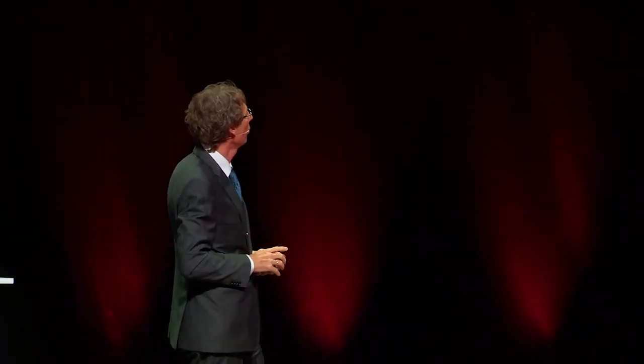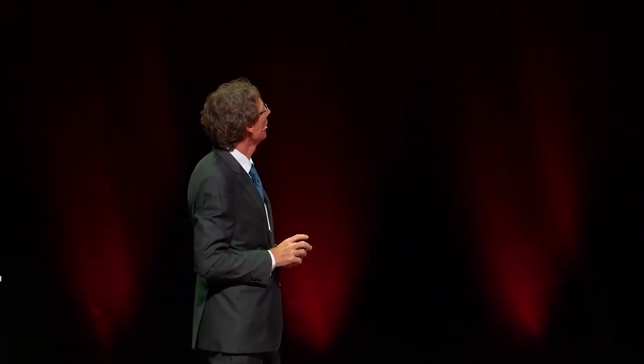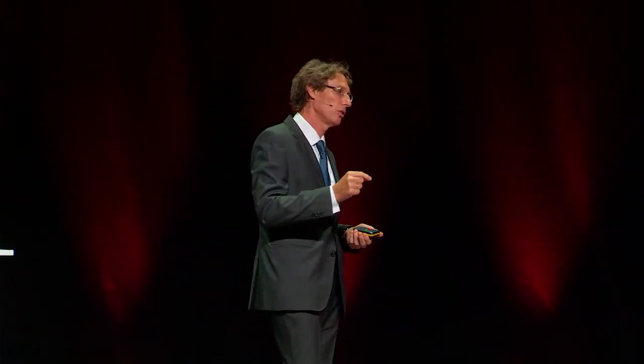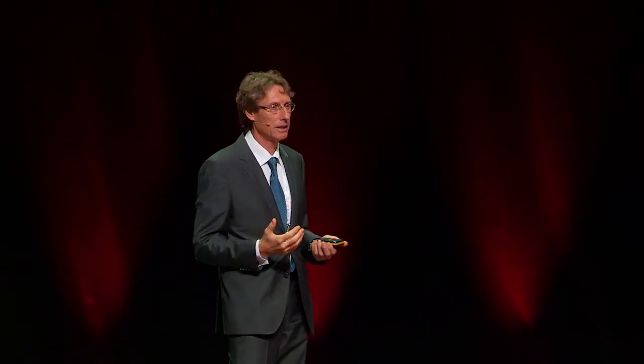So the things we had to learn, which weren't going well, is we had this wear of the PMMA veneers. So now we know that with the composites, we use here the Gradia from GC. It's amazing the hardness of this composite, and if I have to adjust a little bit the occlusion in the mouth, the sensation is really like ceramics.